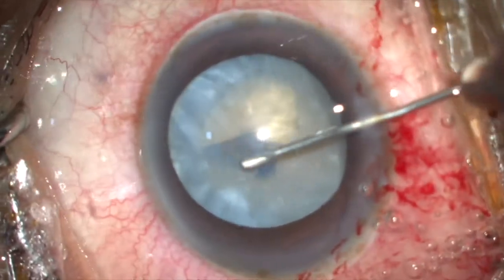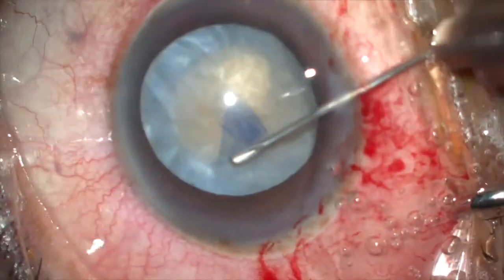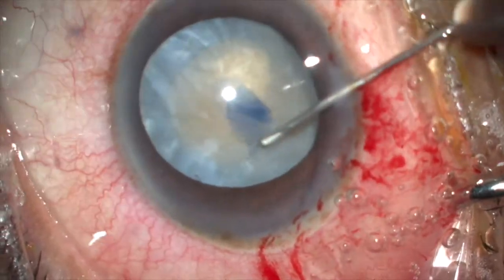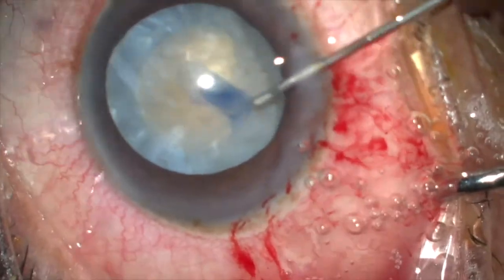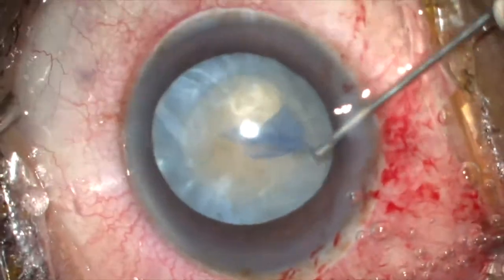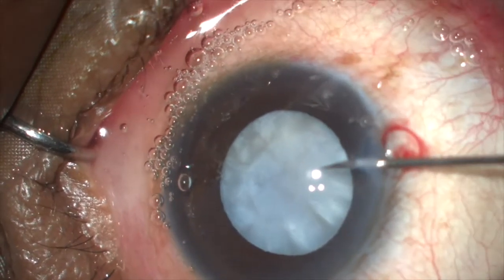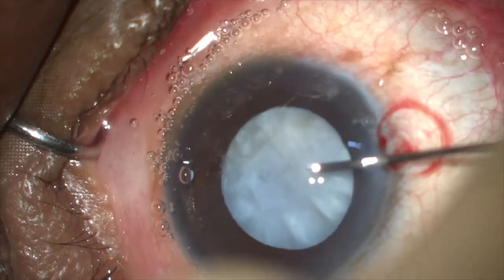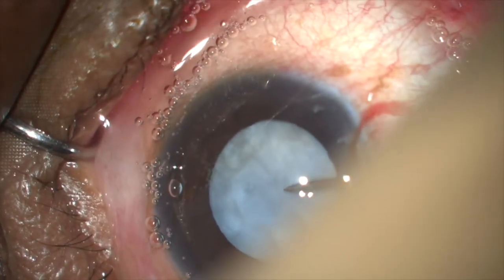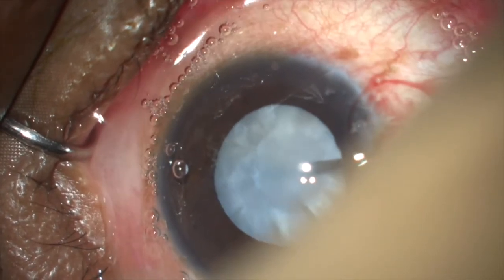Keeping in mind that the anterior chamber should be completely filled with viscoelastic at all times. For hard mature cataract, this technique can be preferred where the cataract has liquefied cortex, where the chances of rhexis running away, tearing, or extending are very minimal or nil with this technique.